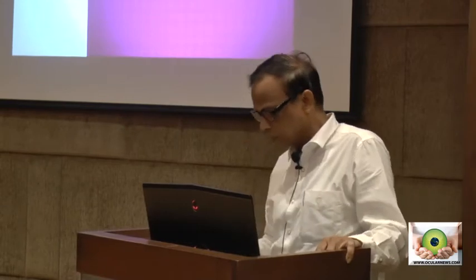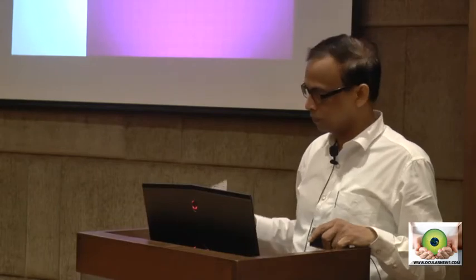At places where even the cyclodestructive procedures were not available, we used to have the only option of enucleation in a painful blind eye. These cyclodestructive procedures have also come a long way now, and today we are looking at a cyclodestructive alternative to trabeculectomy and glaucoma drainage devices, and this is what ECP is. The studies done on ECP have claimed that it is a better alternative to filtering surgery in several situations. As we go through these slides, I will try to summarize all the points I have mentioned till now.